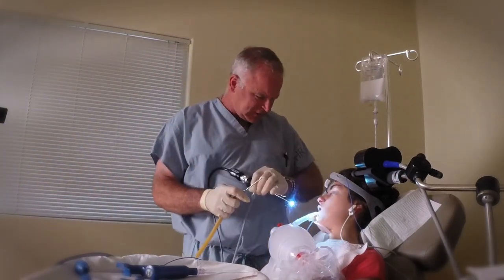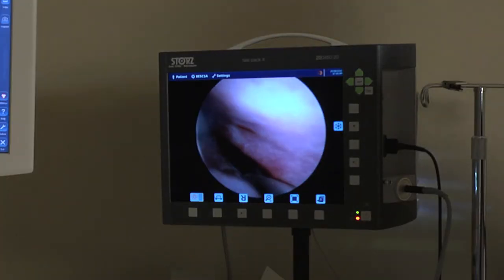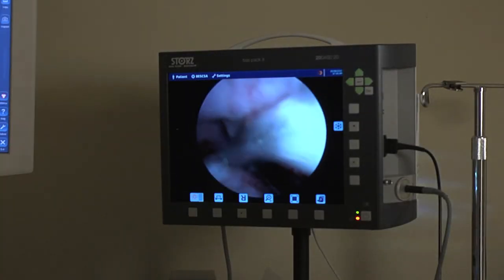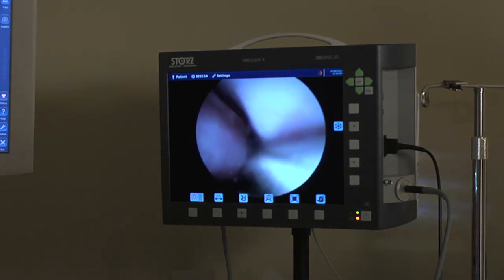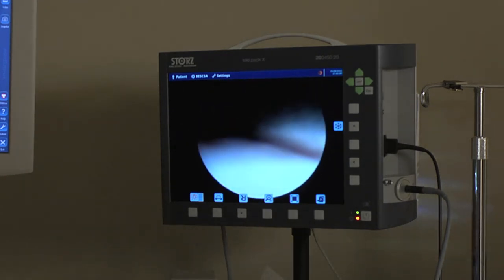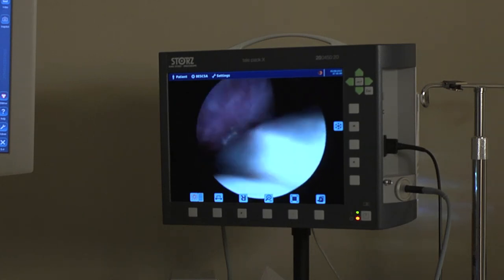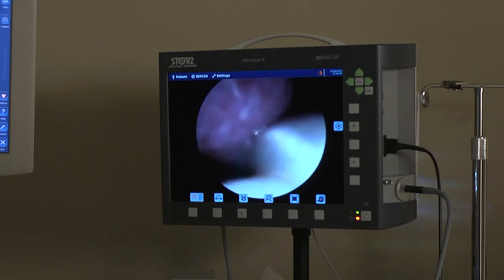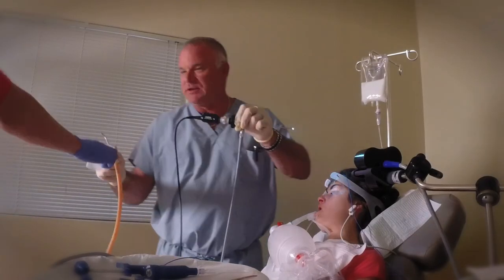And that's really the end of the procedure. That took about five, six minutes. I'm just going to go in here and clean out with suction. We've already opened all the sinuses and we've done the turbinates. There's a lot of infection coming out of the right, which is telling us. And that's it.